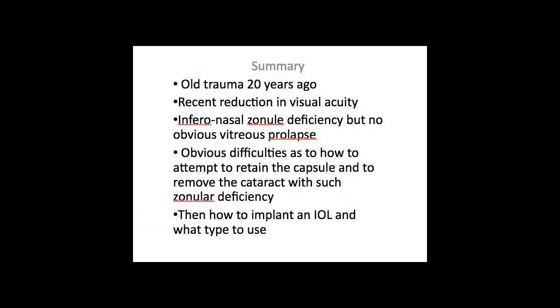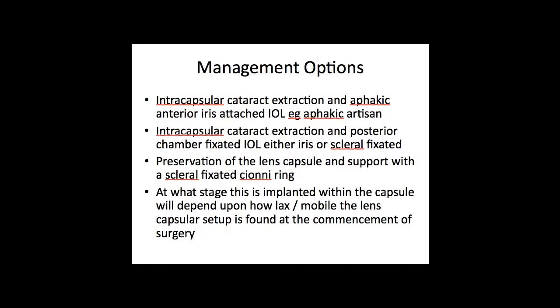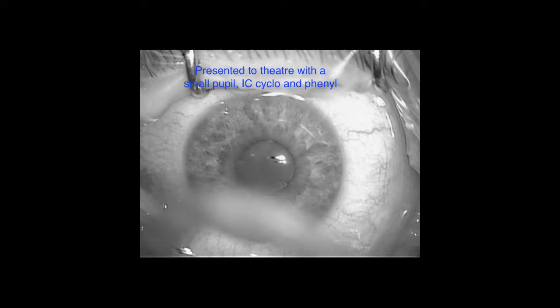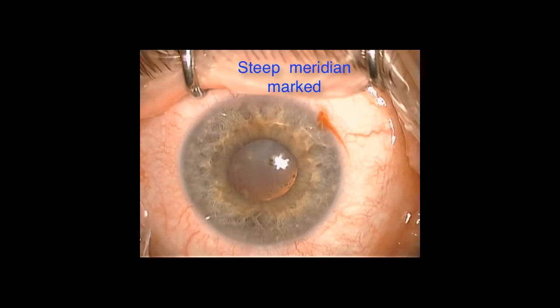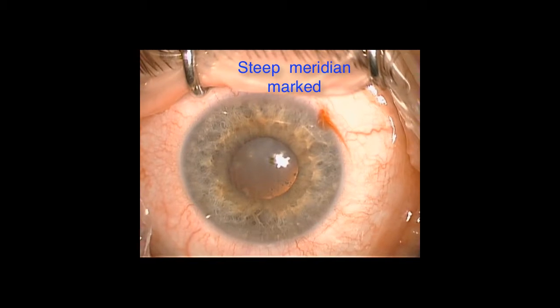Present a summary of the findings and issues to be addressed. Now we outline various management options open to us to manage this difficult case. The patient presents to theatre initially after delay with now a small pupil.